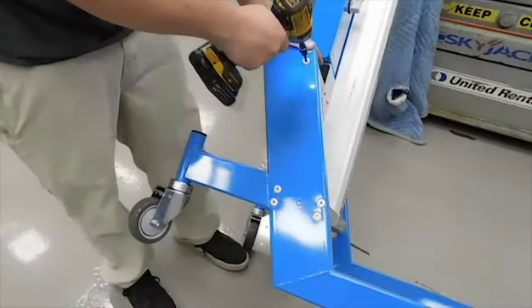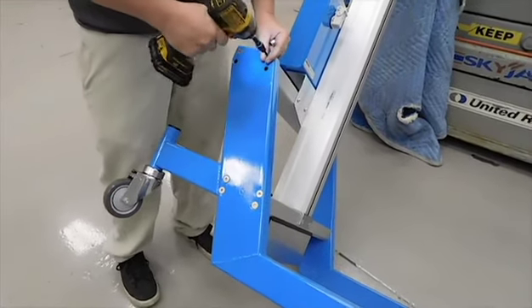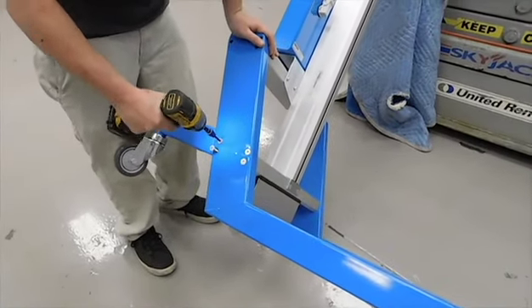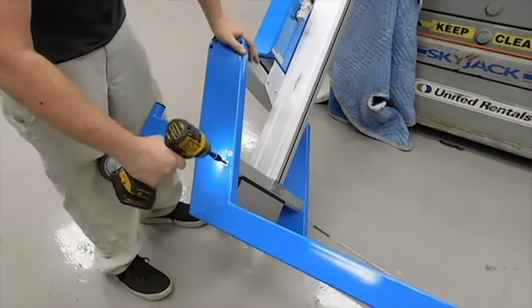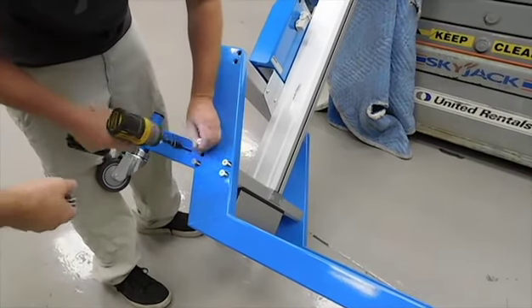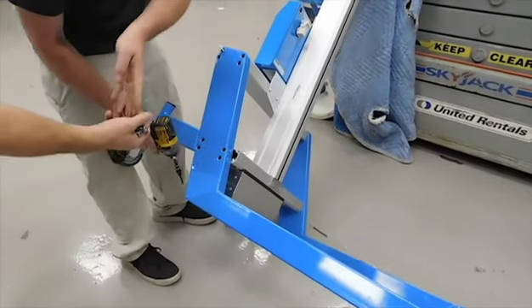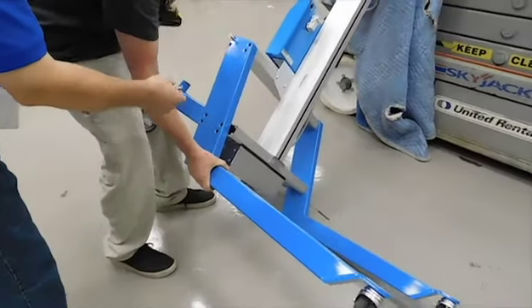Remove these eight bolts from this leg. We're using a five-millimeter wrench right now to take the leg apart and get the eight bolts out.